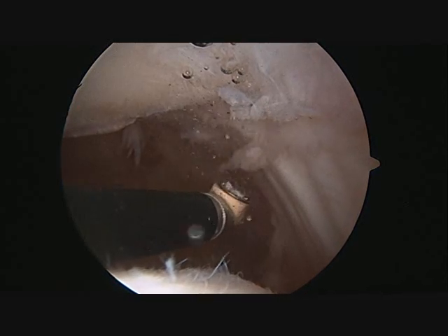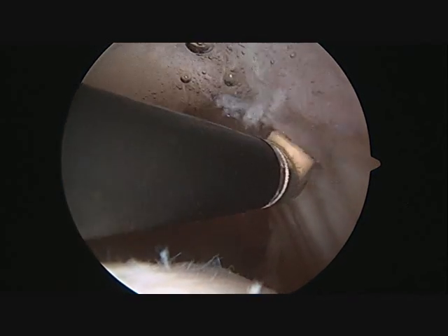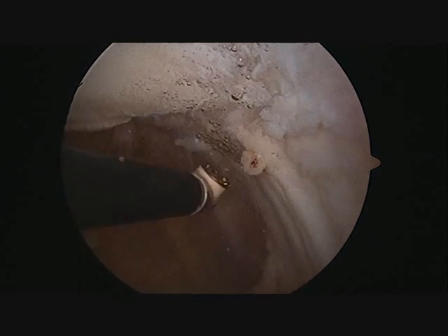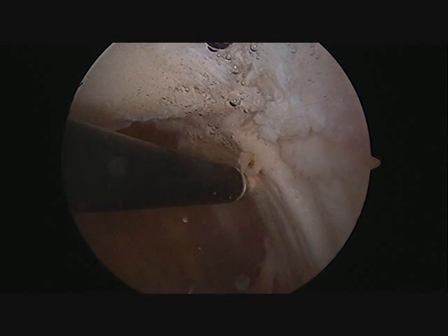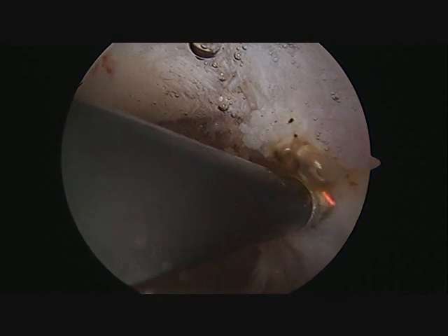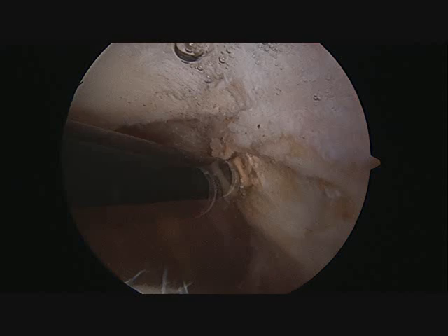This particular condition responds well to an arthroscopic lateral release. The arthroscopic wand is then inserted into the knee after the boundaries of the kneecap have been identified. The synovium is removed first, followed by releasing the tight retinaculum, which is a fibrous layer of tissue that holds the kneecap in place.